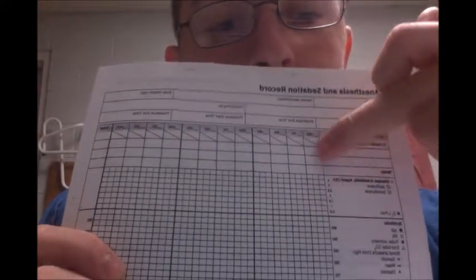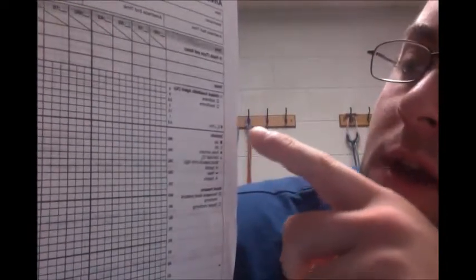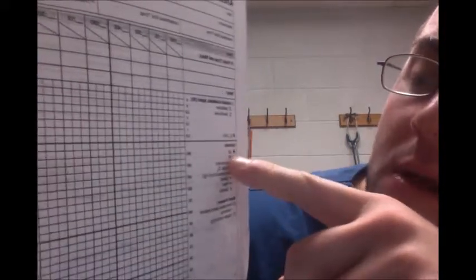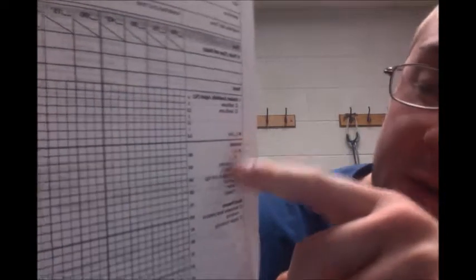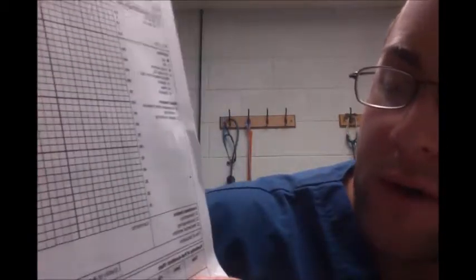You got the times right here, and we've got all kinds of stuff along the side here with our symbols. So we've got the inhalant, anesthesia agent, so isoflurane is what we use here, so we always X that. We've got the pulse oximeter, right here. That's down here. Heart rate, respiratory rate, the amount of oxygen they're getting, CO2 level, and then blood pressure levels. And then we have to mark down for doing rebreathing, non-rebreathing, quality of recovery, time of extubation, all that good stuff. So that's our anesthesia form.